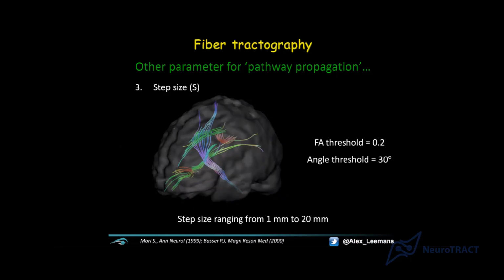Okay, so voxels we acquire. Step size is related to tractography, and tractography is continuous. You go through the data in a continuous way, but if you're not at the specific location of a voxel, you just look at the information around that location, and these are, let's say, the 4 or 8 neighbor voxels. Depending on the type of interpolation, you may have heard of nearest neighbor interpolation, linear interpolation, or bicubic spline interpolation. These are all types of interpolation strategies. Yeah, it is cool, I know. That's why I do this for a living. You script and program these kinds of algorithms, and it is pretty cool.